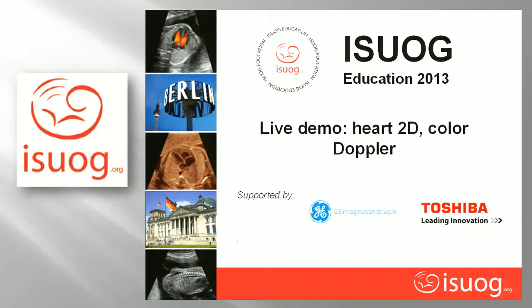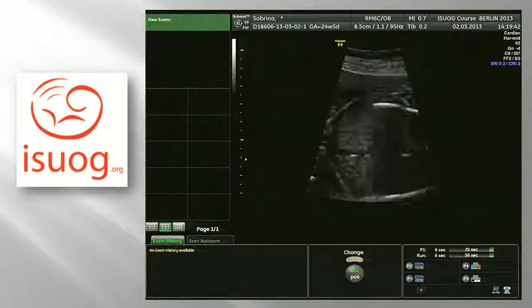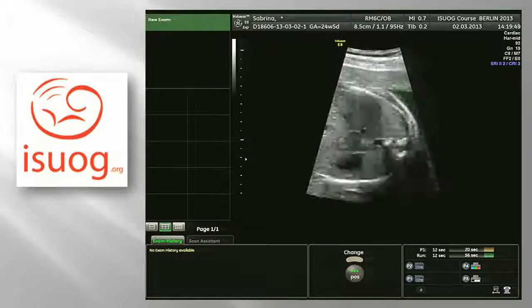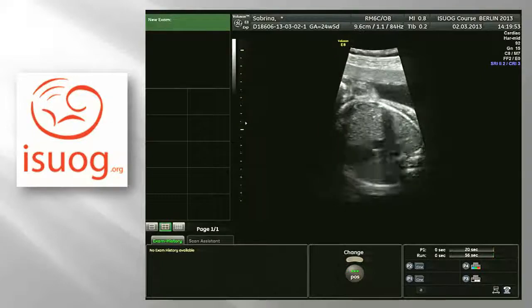If you have a high-risk patient, it's easier, but very few are in a high-risk condition, and this is why now Kai is scanning a patient at 24 weeks. And I can say a few words. This is from Dr. Nauschutz. I think she's sitting somewhere here.